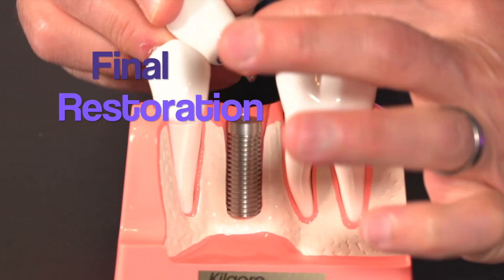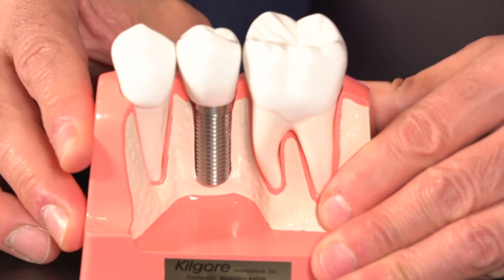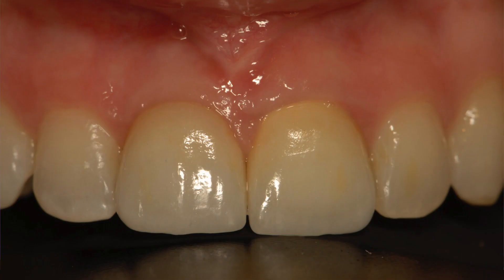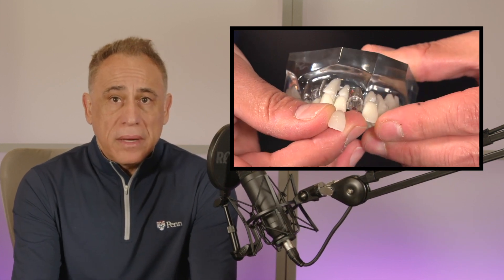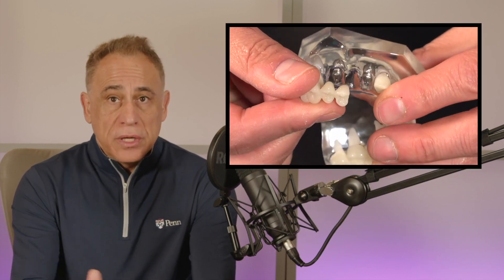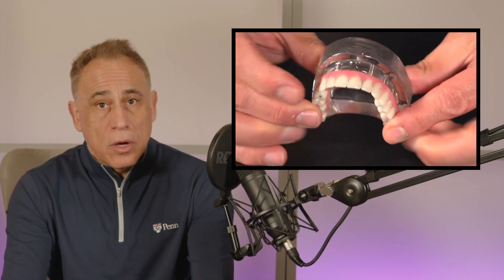And finally, we have the final restoration. This is the artificial tooth that is attached to the abutment and supported in turn by the implant fixture. The final restoration is custom made to match the size, shape, and color of the patient's natural teeth in order to create a very seamless and natural-looking smile. It might be made in the form of a single crown for replacement of a single tooth, a bridge for replacement of multiple teeth, or a full arch restoration for replacement of all the teeth.